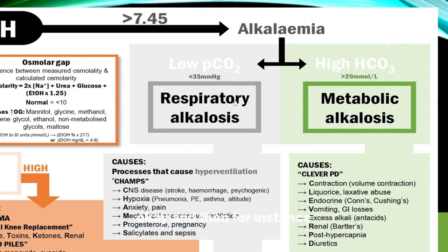For instance, you had a pH that was more than 7.45, and you went to the third step where you identify the primary process, and you found that the carbon dioxide was normal. You would have moved to the bicarbonate level. If you look at the bicarbonate and you find that it's more than 26, then that is too much, and therefore there's metabolic alkalosis. What is going to be the secondary process, or step number 4? It's going to be respiratory acidosis.